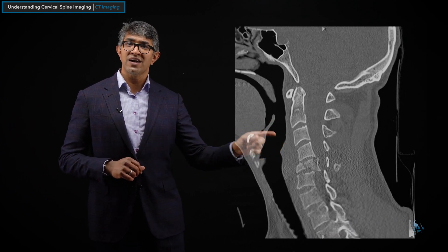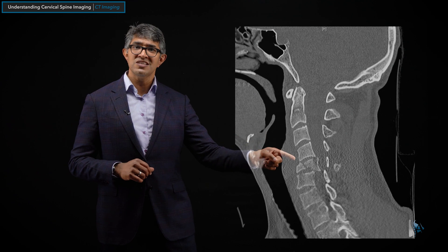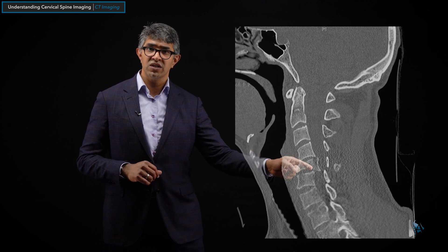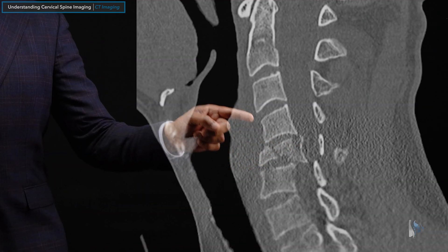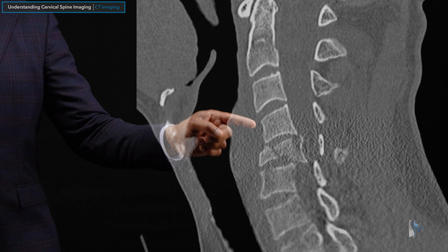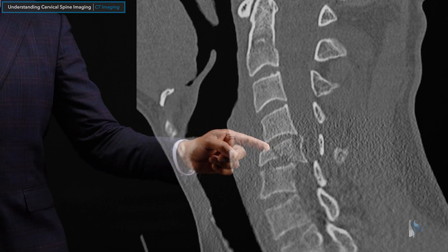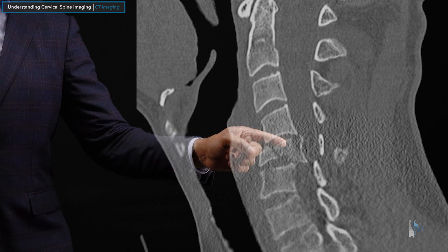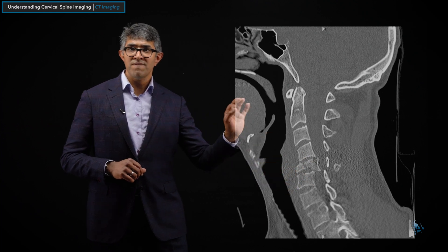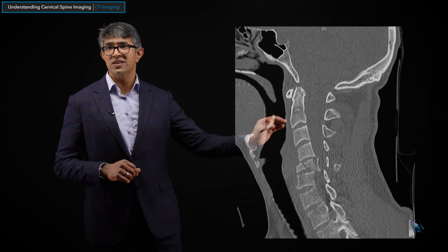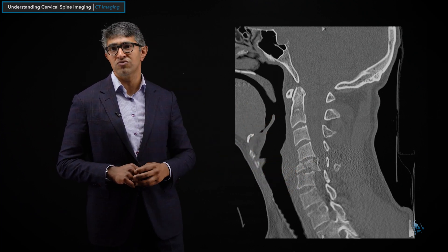Similarly, if you look at this person, they had an unfortunate fracture in the C5 vertebral body. You can see that usually the vertebral bodies themselves are rectangular in shape. This one is fractured and parts of it are actually encroaching on the spinal canal — an unfortunate situation that can cause pretty severe spinal cord injury.